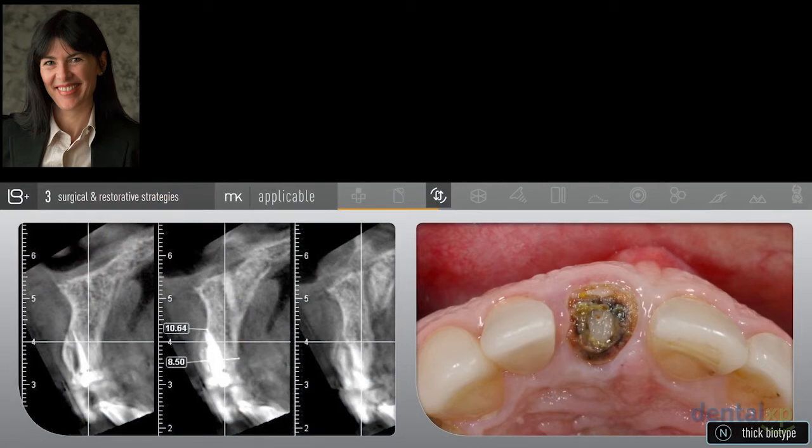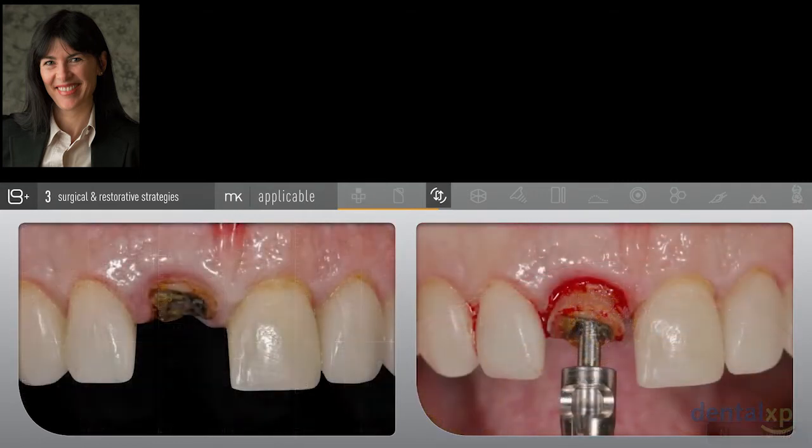This, to me, when I look at the clinical, it's a great case. Nice, robust tissues, periodontally healthy patient. Radiographically, I've got good palatal bone, good apical bone in which to engage my implant. This is an excellent case for immediate implant placement. So my charge is now to carefully extract a tooth, using a variety of different instruments and tools that let me elegantly remove teeth without damaging hard and soft tissues.